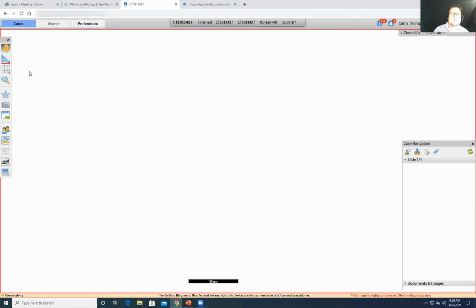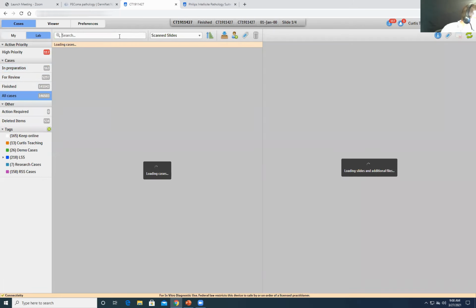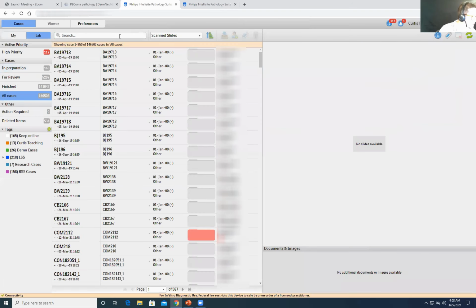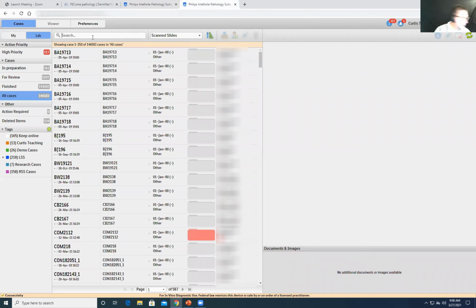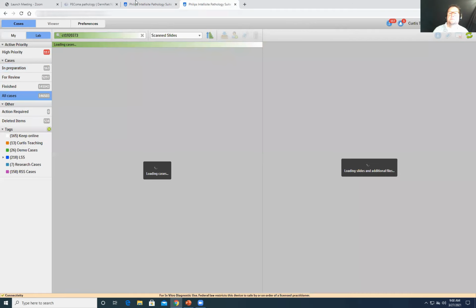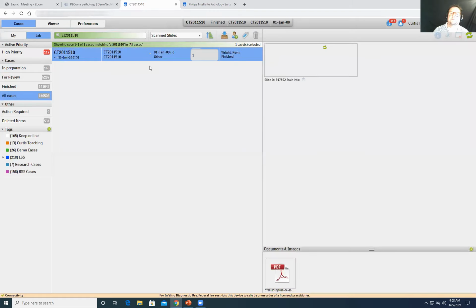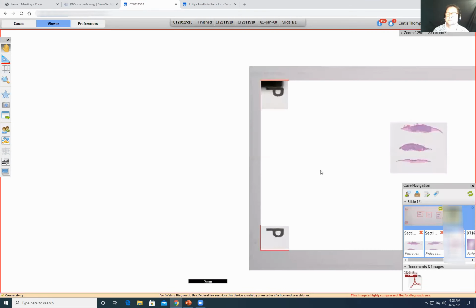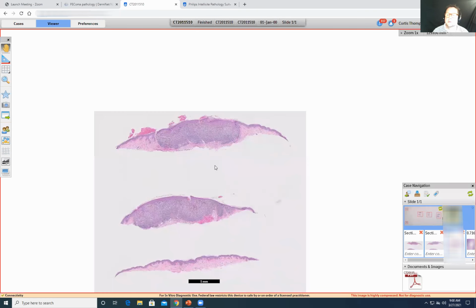This one too. So on number 7, 7 is CT20-11510. See if I can tee up the next one, CT19-20373. See if that works. Okay, so here we have, that one is a little bit blurry there.